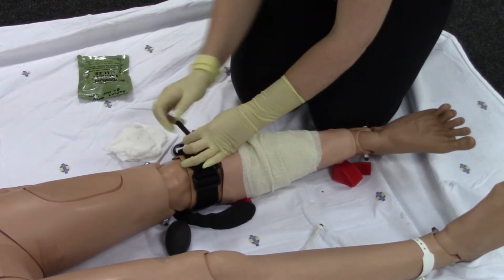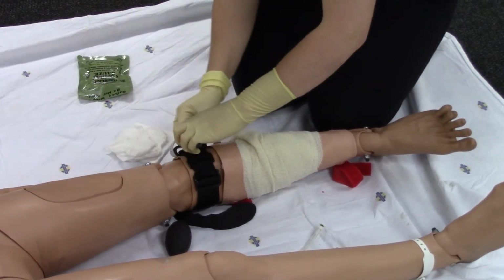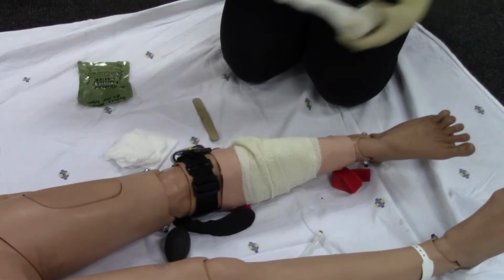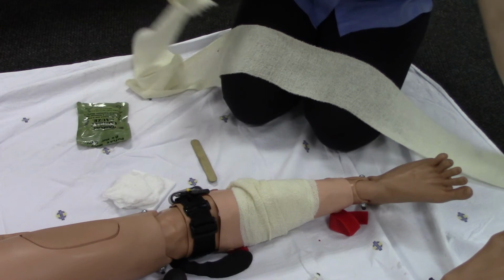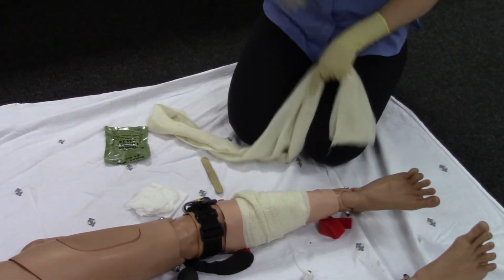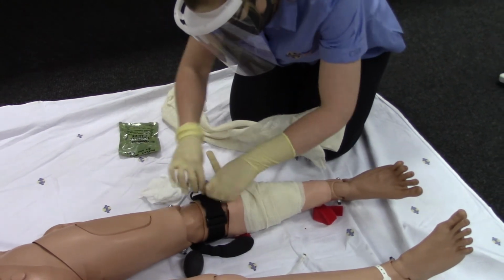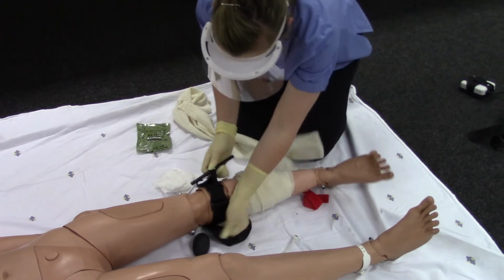Application of an improvised tourniquet should you not have access to a commercial tourniquet. Removal of the tourniquet in this instance is for demonstration purposes only.